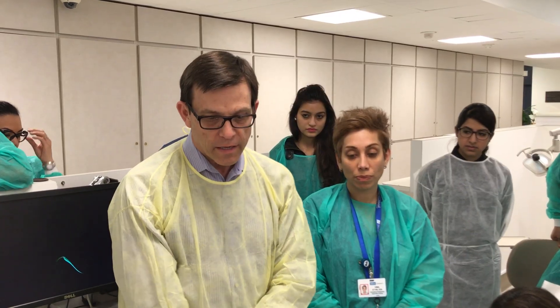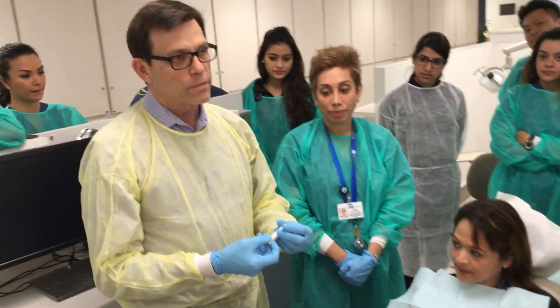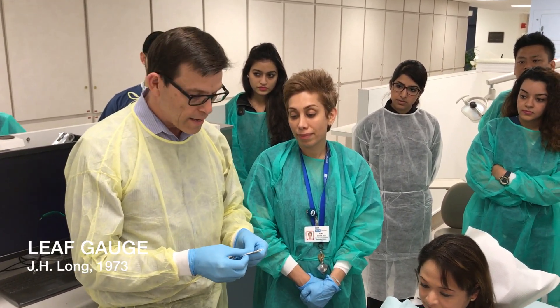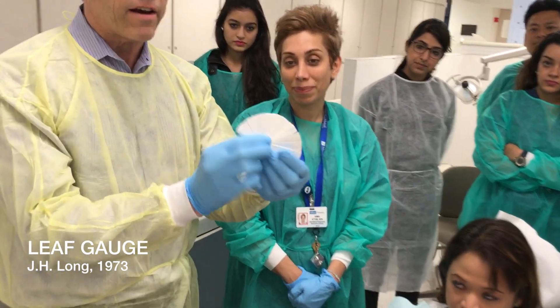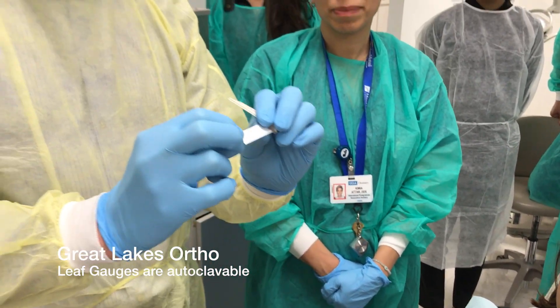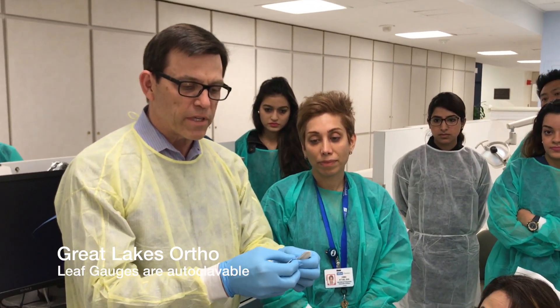We're essentially going to use a technique called the leaf gauge technique. This is a technique that's been around for a long time — probably over 40 years now, 1973 or so. This technique was described by Long. And it's essentially this fanned-out set of leaves. Each one of these leaves has a thickness that's approximately two-tenths of a millimeter, about 200 microns.